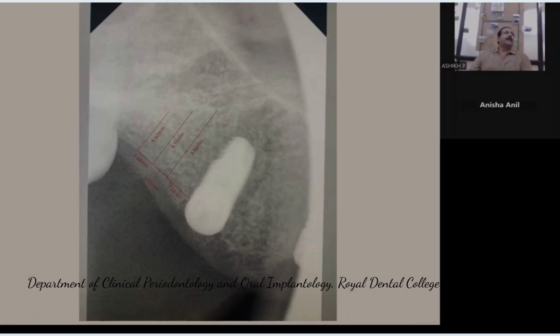So, from what you saw on the clinical side, I don't think that wide ridge is there. So that is going to be a wish of yours, not a possible thing. So considering it to be lesser than that, you have implants ranging between 8 millimeters and beyond. So 8 millimeter is your shortest possible implant in this case, not 6.5. So 6.5 means you need to have a wider bone area to accommodate the minimum size, which is 4.25.